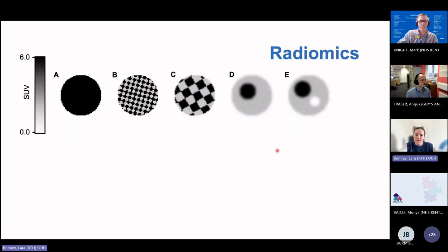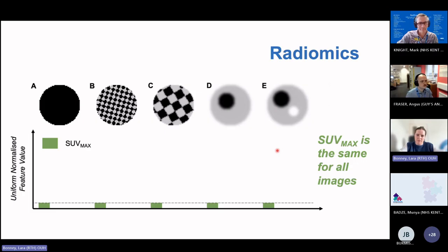And this is important because lots of very, very different tumors, see here my very physics example of tumors, can have exactly the same maximum signal. So if you were to look at these as a computer, if you're looking at 5 different images, they're very, very different, but actually they have the same maximum signal. So if we wanted to better characterize them, we need to use more complex quantitative measurements to understand what these images are actually showing about the metabolism in the tumor. And particularly relevant, how that metabolism is varying throughout the tumor.